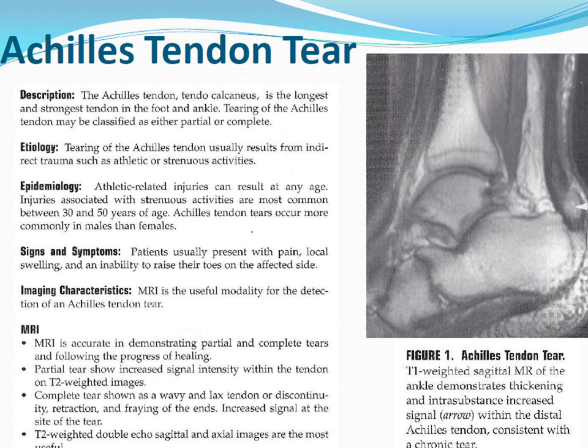If it's a complete tear, they're going to have to pull it down. So just like with the quadriceps tendon tear that I mentioned, you just want to make sure that you include, with your imaging, if it goes up high enough, the distal part of the tendon, so they know what the gap is between the tendons. So just keep an eye out for that if you're imaging an Achilles tendon.